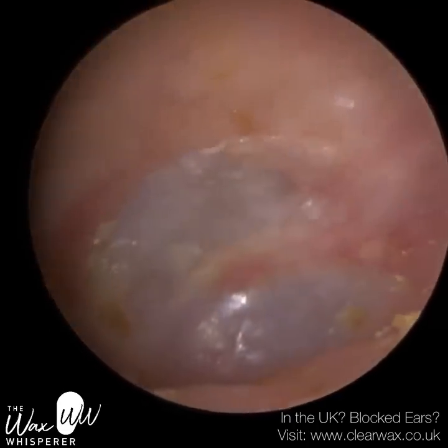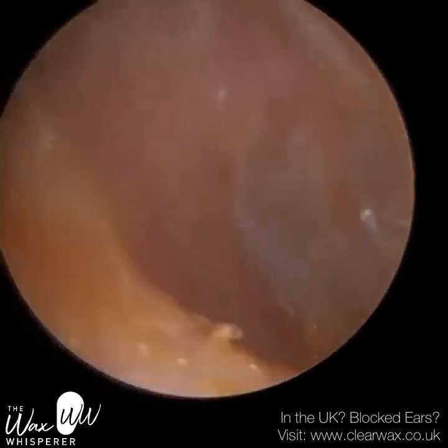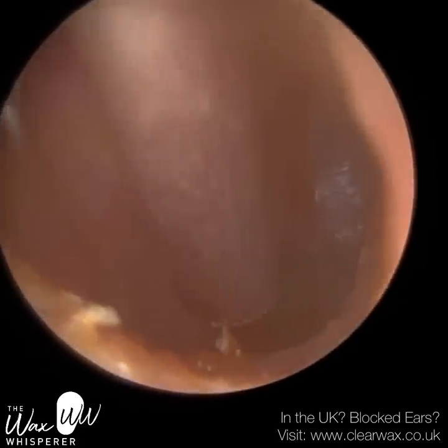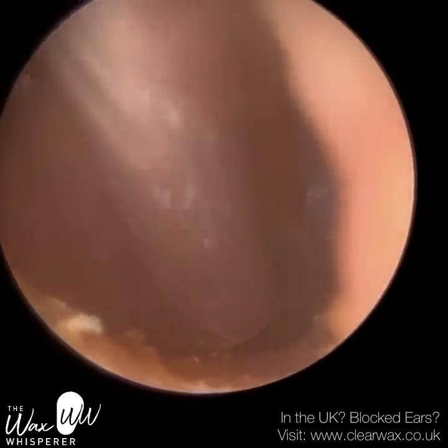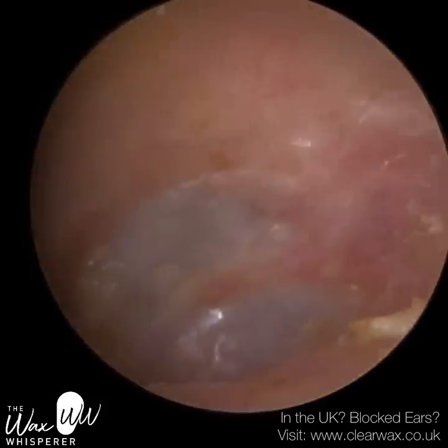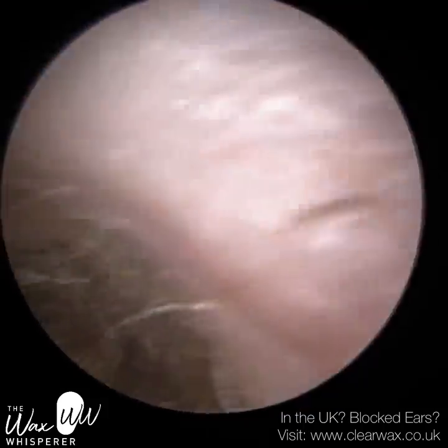There's just a speck of wax at the floor of the ear canal — I'm going to hover over that to see if it comes away. The ear canal is quite bumpy, going up and down. So there are quite a few anatomical challenges in this particular case. And we're done. The patient is really pleased and can hear again. The eardrum looks healthy.